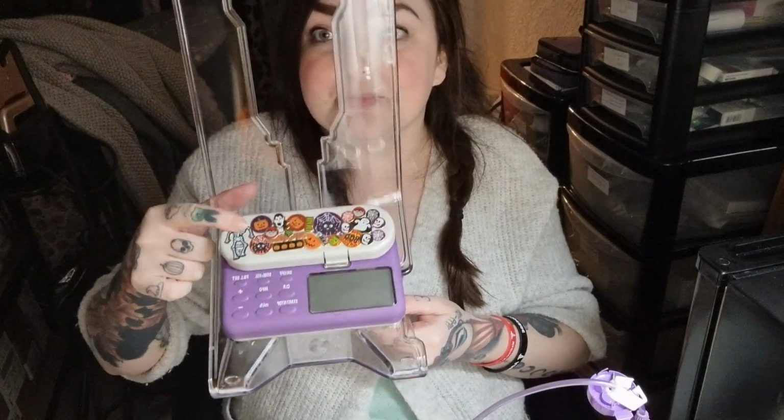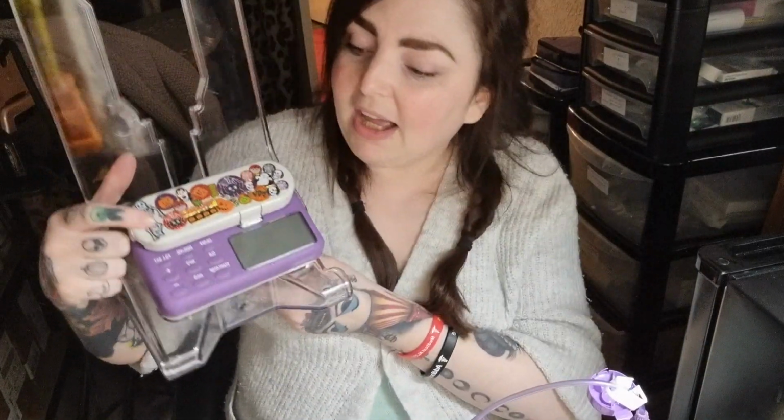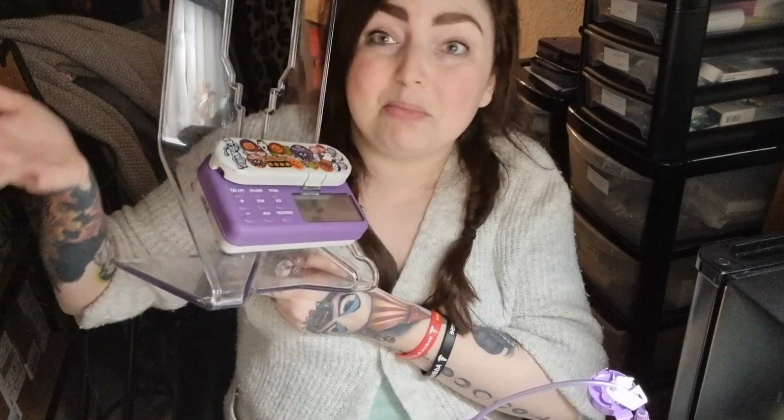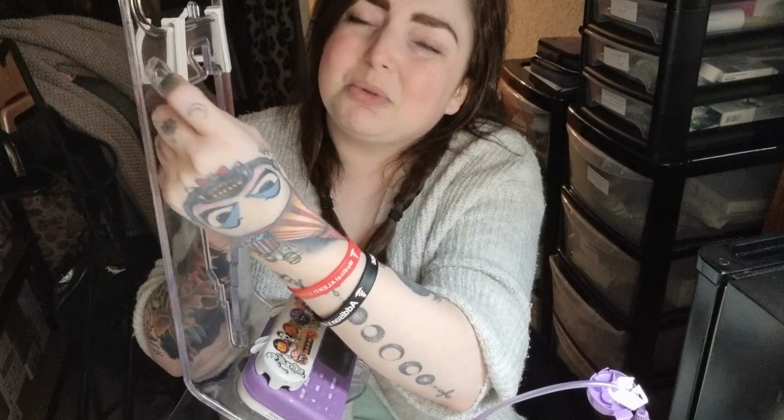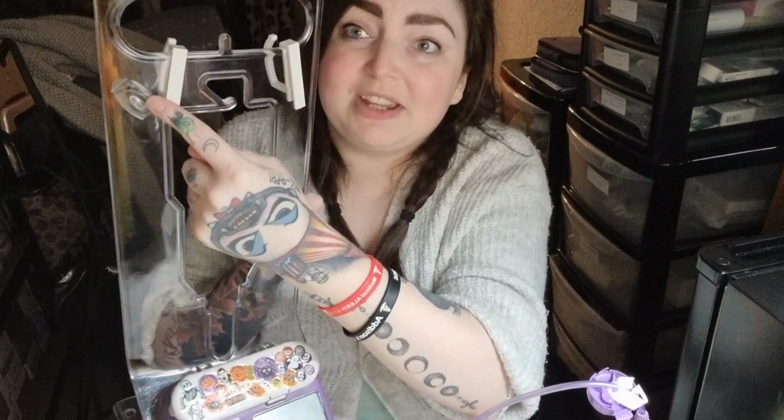So then this little friend comes into it. This is my machine, my pump. And this pumps all my stuff into me, basically. I have 2 little hooks on the back to hold that stuff. And I have a tiny little hook that I invented myself. I didn't really invent it. It's one of those little sticky-on hook things. If you want to know what this is or where to get them, just ask and I'll let you know, because it's the best idea ever.